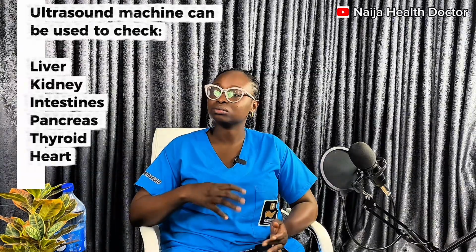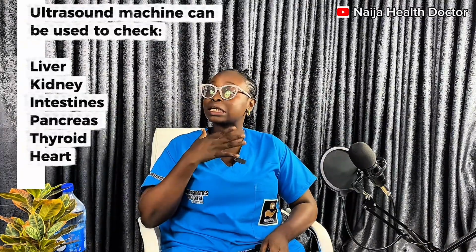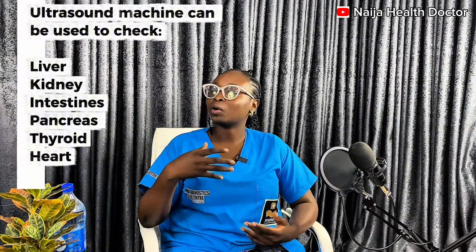We've been discussing parts of the body you can use ultrasound machine for. Okay. Is that all? No. You can use ultrasound machine to check your organs like liver, kidney, the spleen. You can also use it to check your intestines, the small intestine, the large intestine, basically the bowel loops. You can use it to check your pancreas. You can use it to check your neck. That's thyroid. That's neck scan. You can use it to check your heart. That's echo. If you're going for annual general checkup, yes, you need an ultrasound scan.